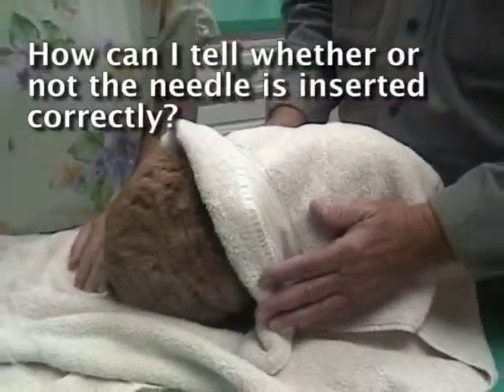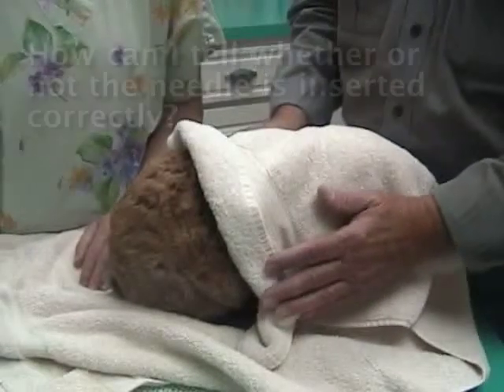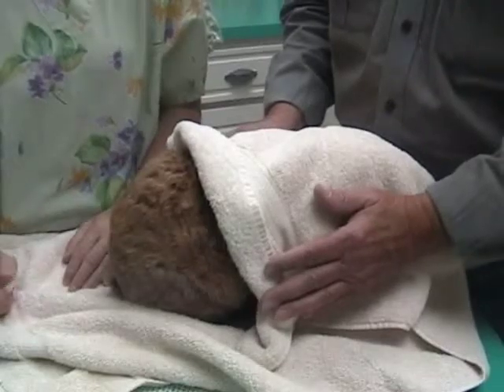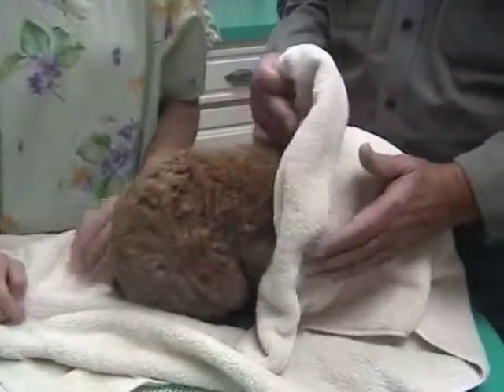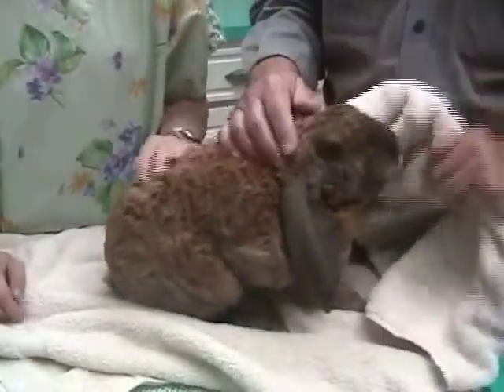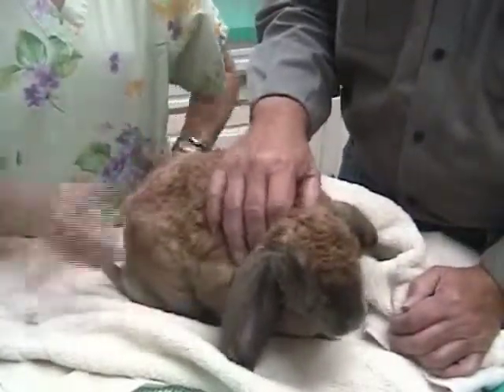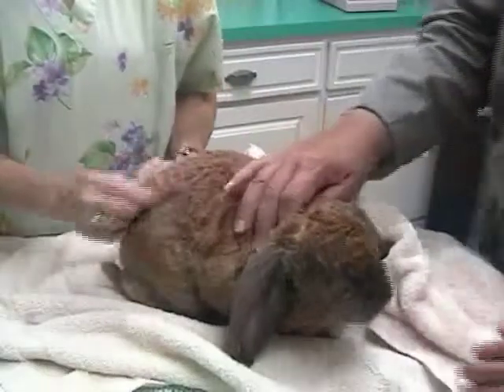The fluids won't flow, but when you're inserting, once you get through the skin, the needle should move relatively easily. If the needle does not move easily, then you've hit something, and you need to back out and try again.